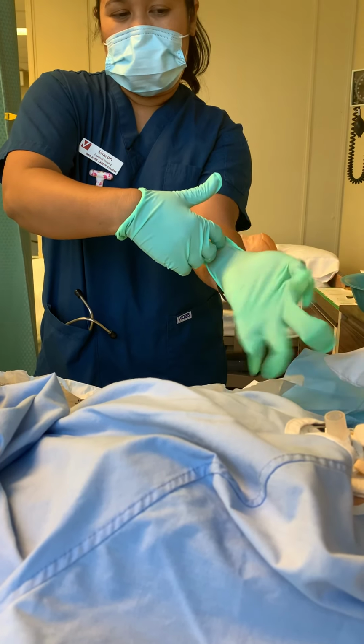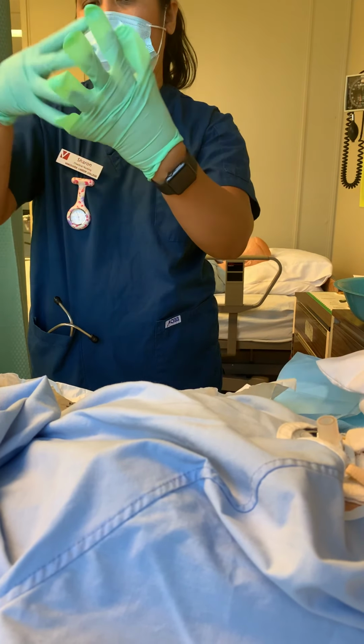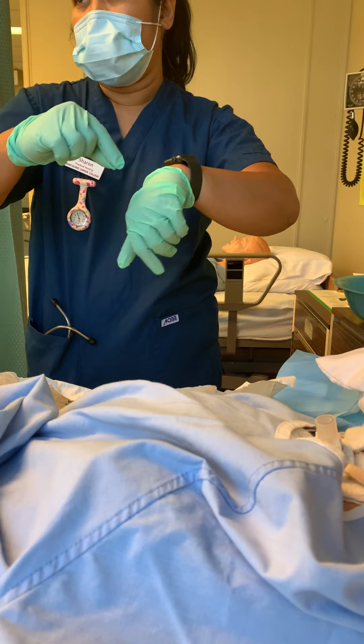Make sure you don't tear it. Now you can fix it because sterile to sterile is okay. With this hand, you don't need to bend it, just pull it down, okay?